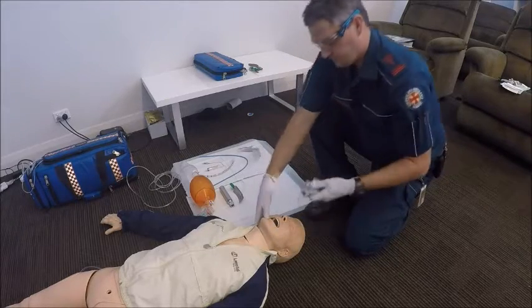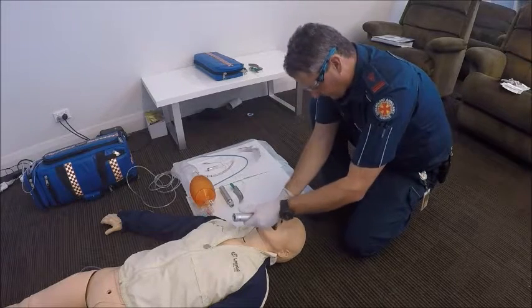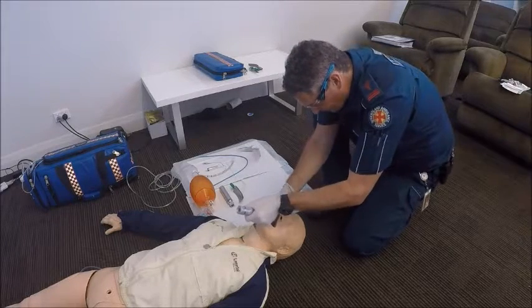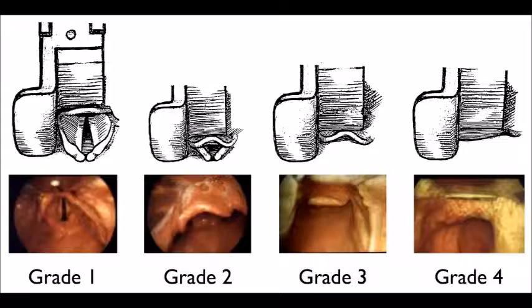Take the laryngoscope in our left hand, insert into the mouth, sweeping the tongue in a right to left motion until the Macintosh blade engages in the vallecula, and then in a forward and anterior motion lift up the laryngoscope to facilitate visualisation of the glottic opening.